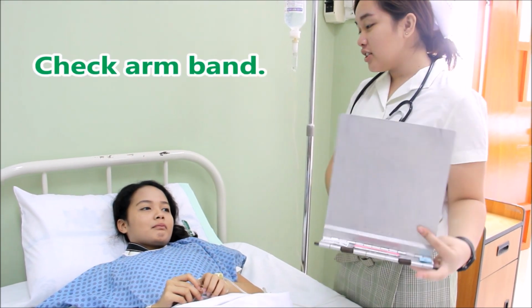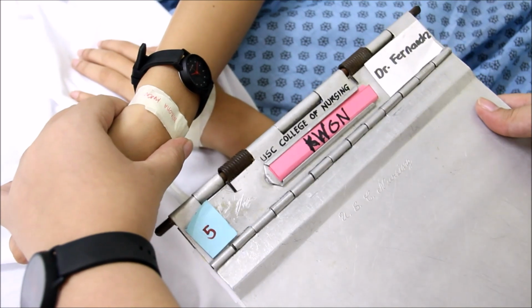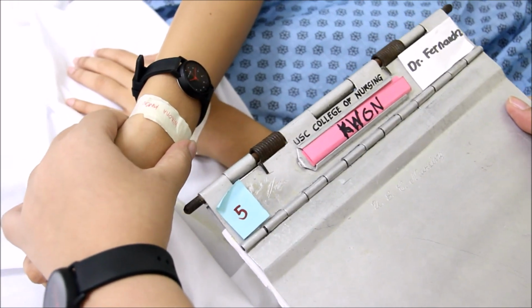Check the client's armband for name and ID number. Do not administer blood to a client without an armband.